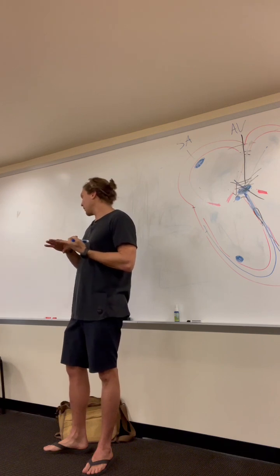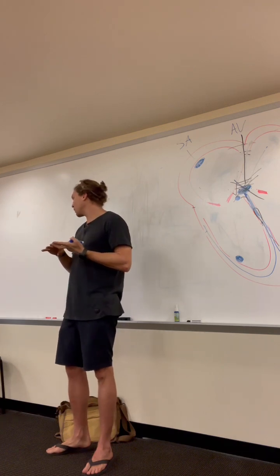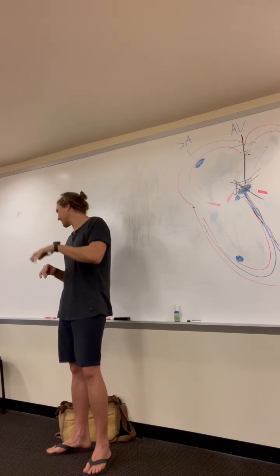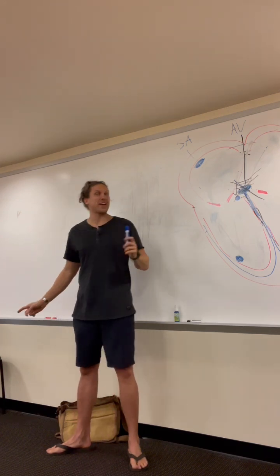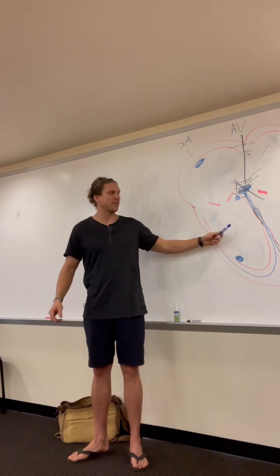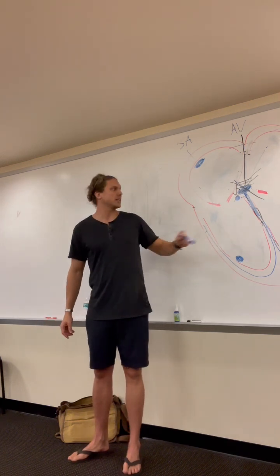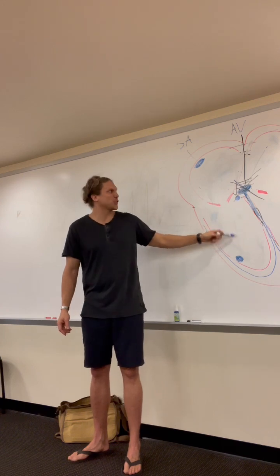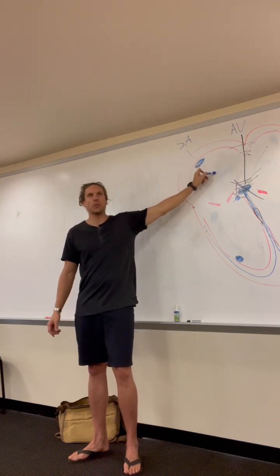Rate, rhythm, QRS, it's narrow. No, sorry. These are wide QRSs. So I know that at least the ventricle part of this EKG is coming from down below. Our next hint is that it's ventricular in nature, but it's also atrial in nature because of the P waves.